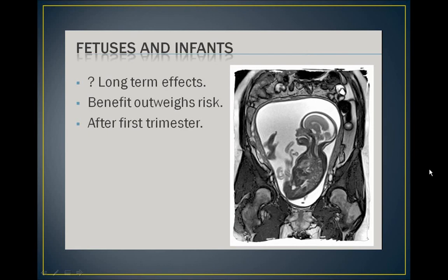As of yet, there are no known biological effects from an MRI on fetuses or infants. But the research data is limited on the issue, and pregnant mothers and parents of infants are usually cautioned against having an MRI just because there is no definite data on the issue, and we like to err on the side of caution. The FDA states that, quote, MRI imaging may be used in pregnant women if other non-ionizing forms of imaging are inadequate, or if the exam provides important information that would otherwise require exposure to radiation, end quote.